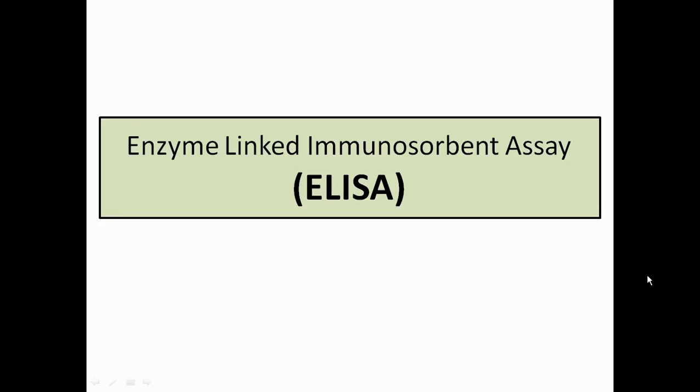Now the major important thing about ELISA is that it is extremely powerful and extremely sensitive, because ELISA can give us the identification of proteins at the picogram level. So that's why it's really important for all the process. So let's talk about ELISA as an overview.